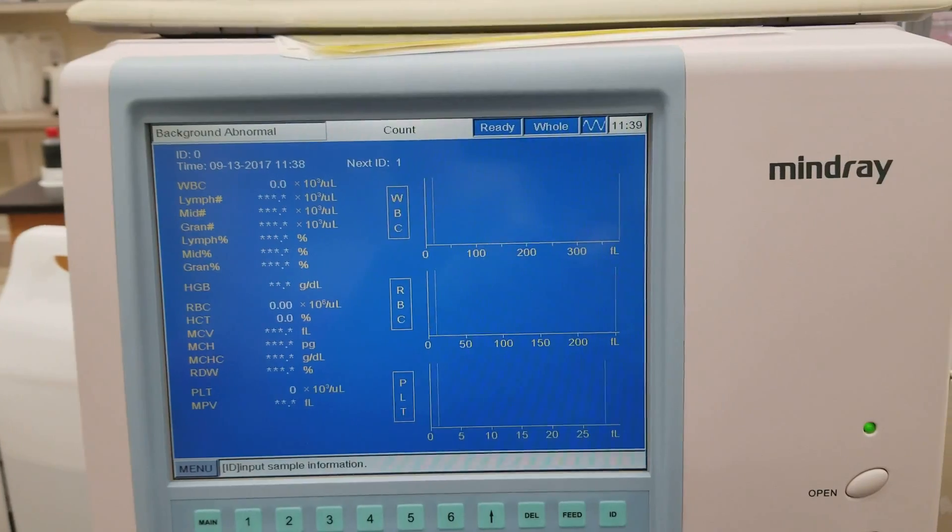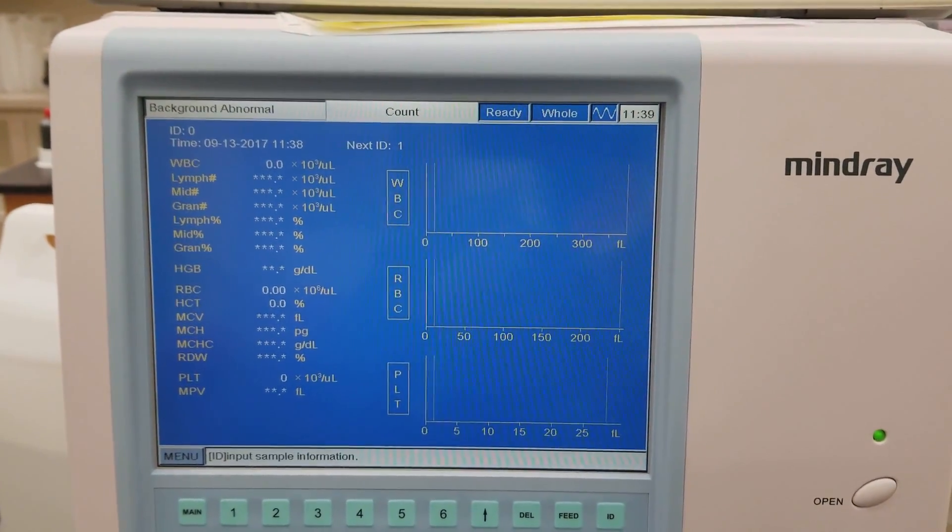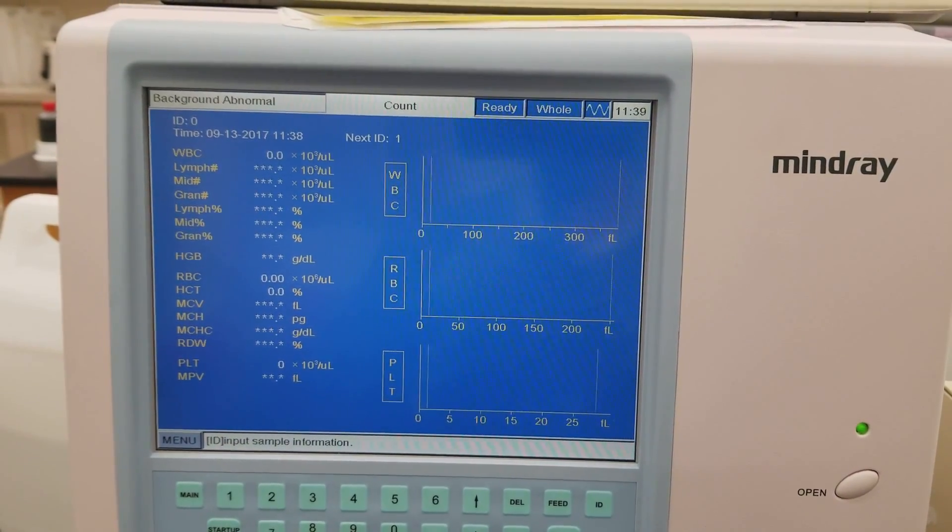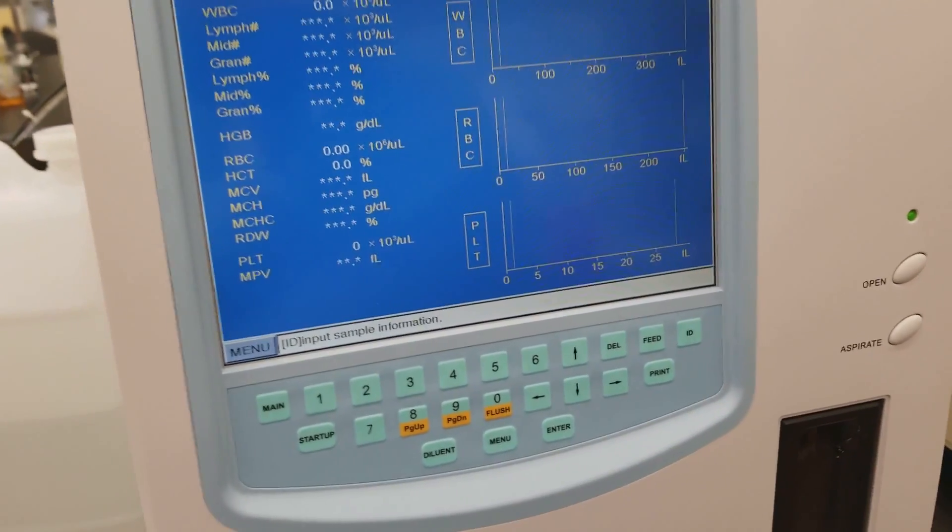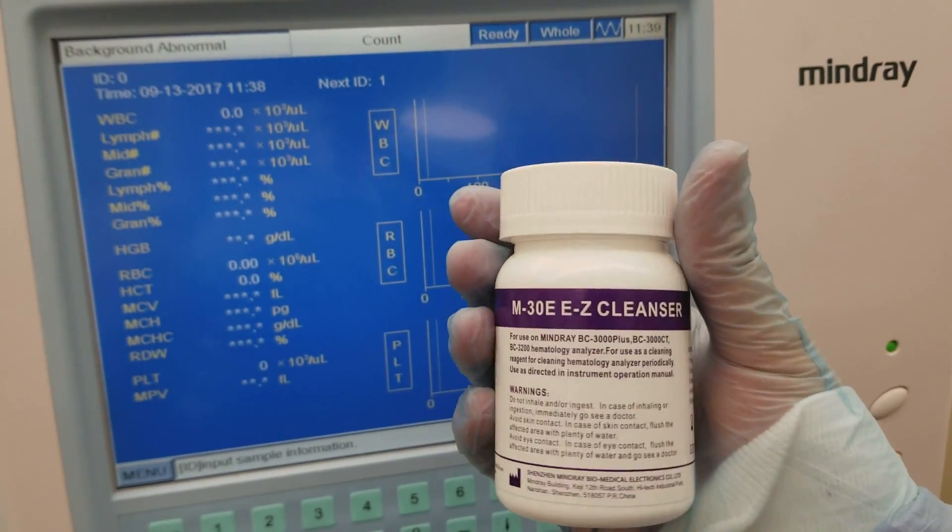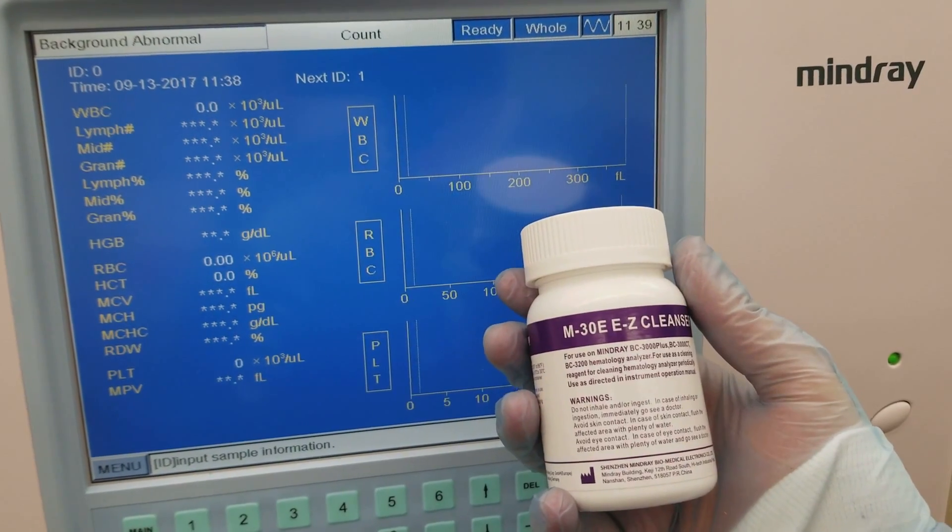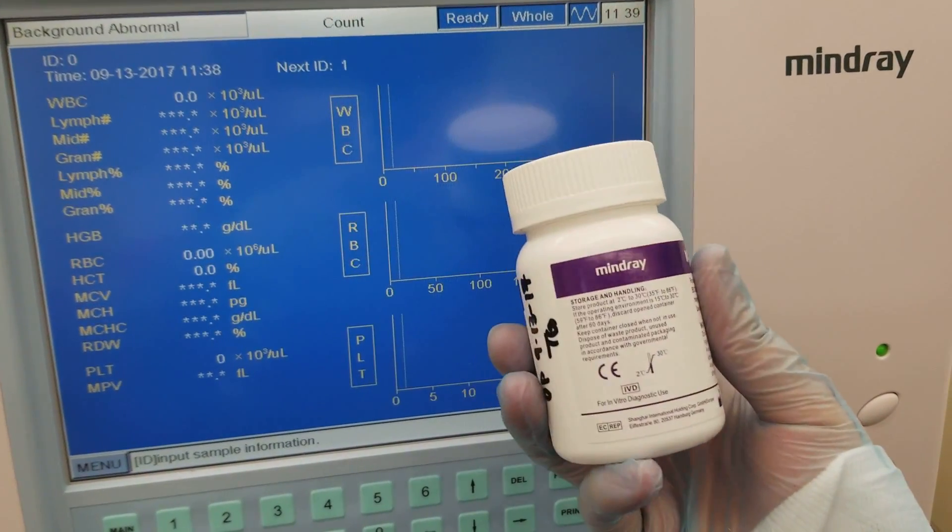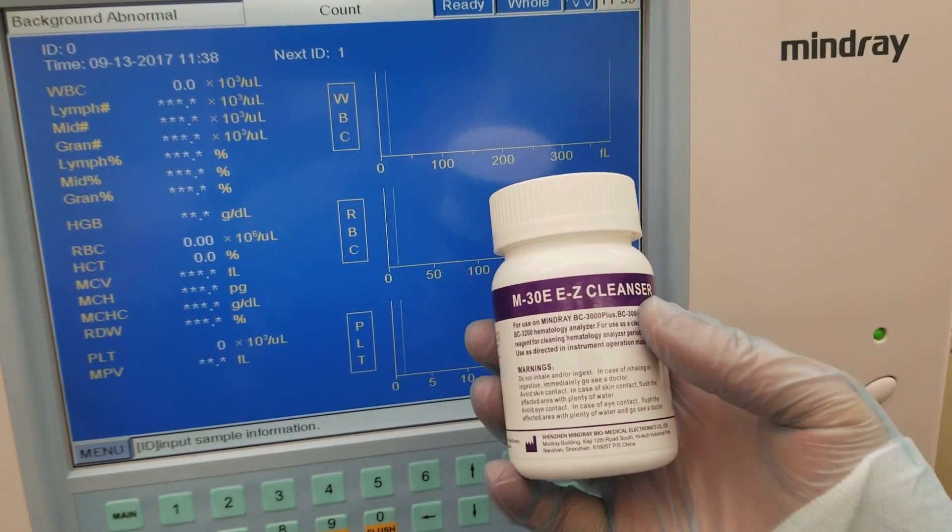Okay, so we still have the errors there, and that is most likely due to the baths not being completely clean. So what I'm going to end up doing is running the easy cleanser. If your analyzer sits for days on end, which ours does because class is only one day a week, you'll have to run this. It's an eight hour period of time that it takes to do this cleanser.